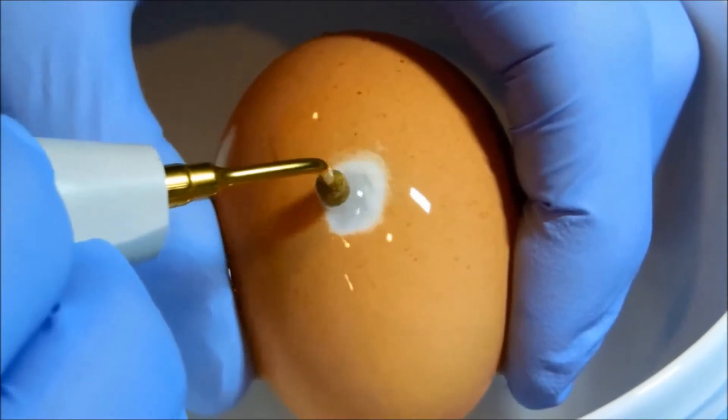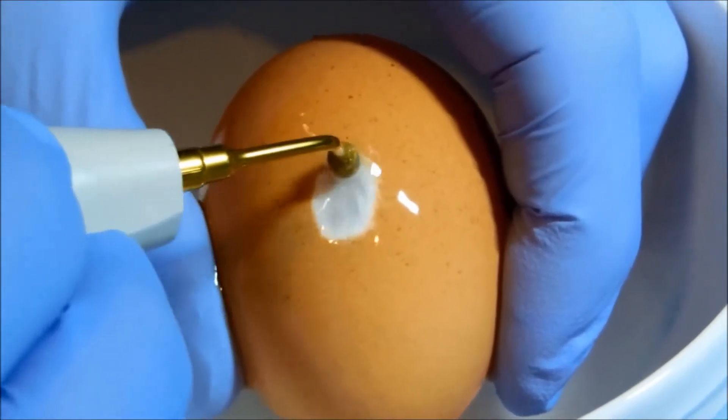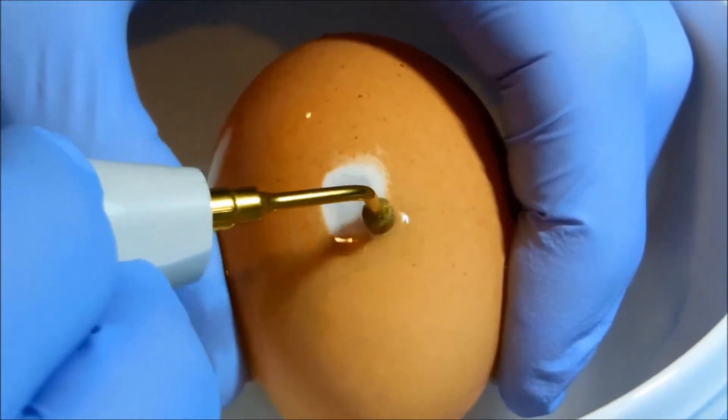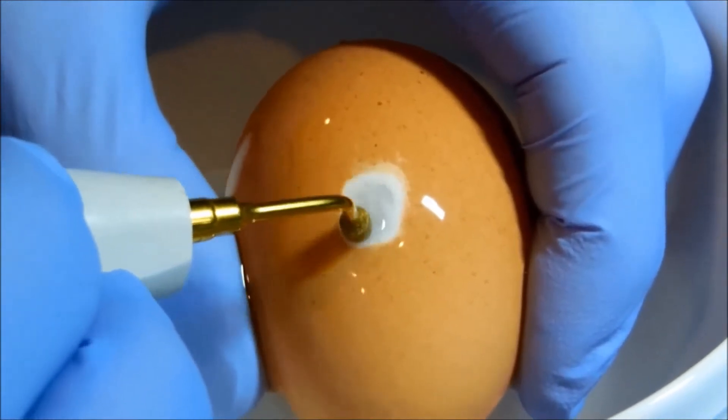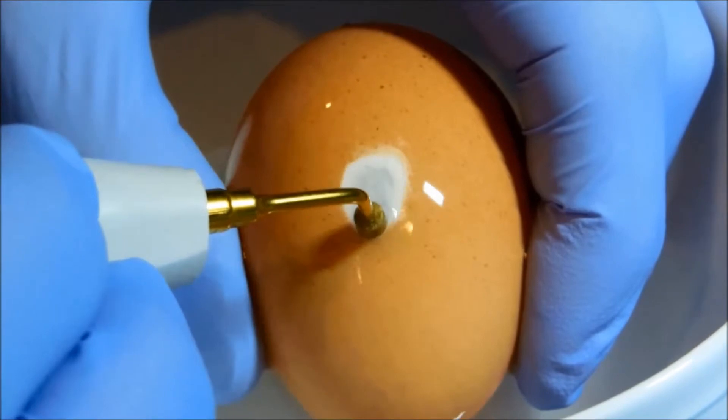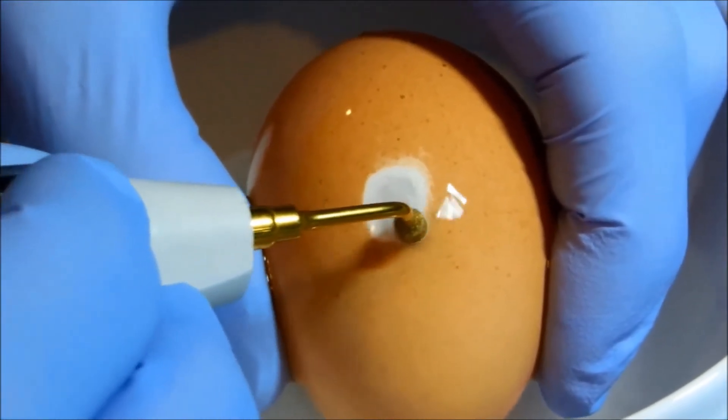It's a very meticulous process. It's done very slowly. And using this kind of technology, using this micro ultrasonic movement, we are able to slowly remove this very thin layer of bone.